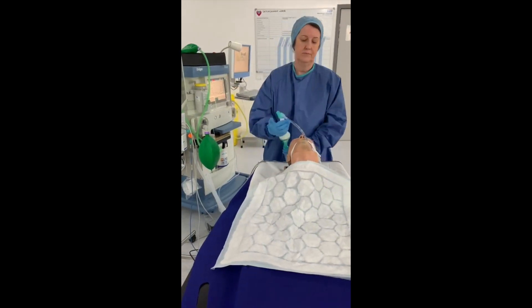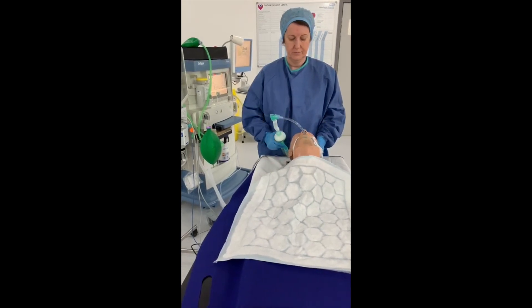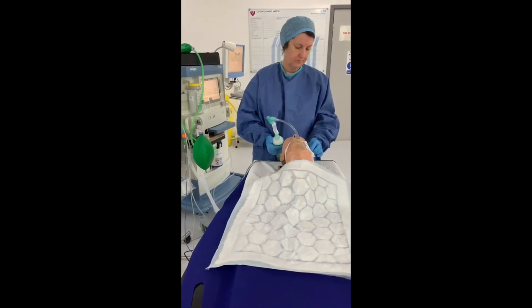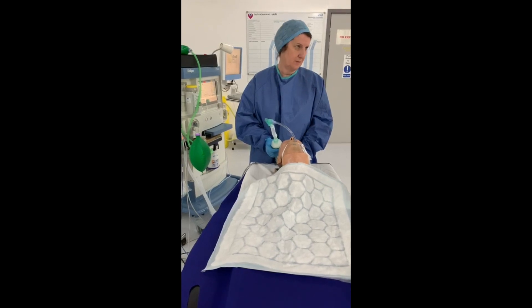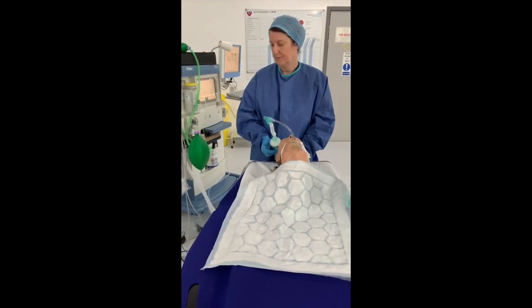Assuming the patient is now in bed, we're going to optimize the patient's position on the bed — sit them upright with the knees bent. We're going to check neuromuscular function and reverse if required. Once reversed, make sure the team are happy with the extubation plan.